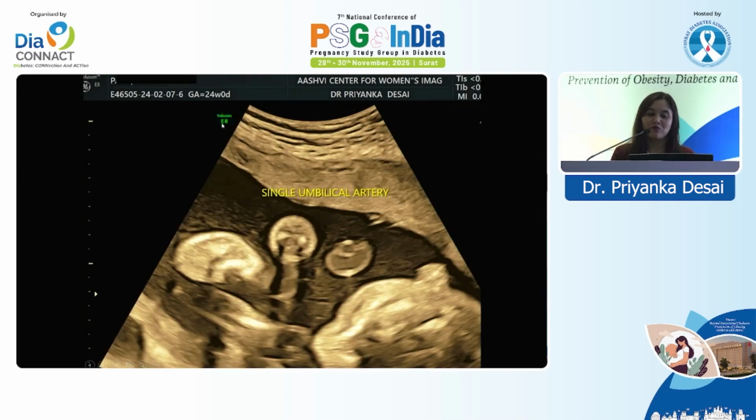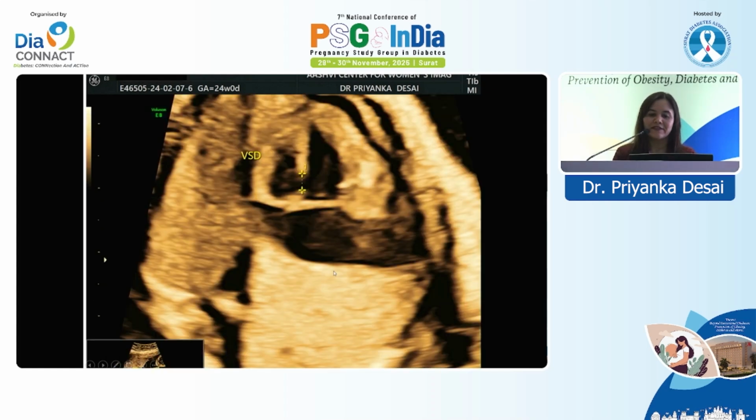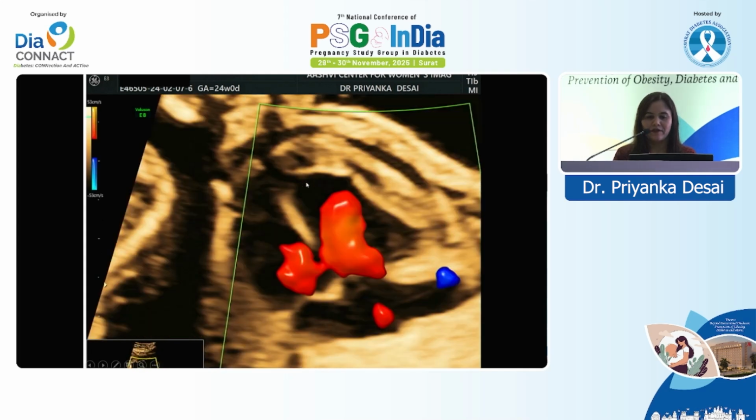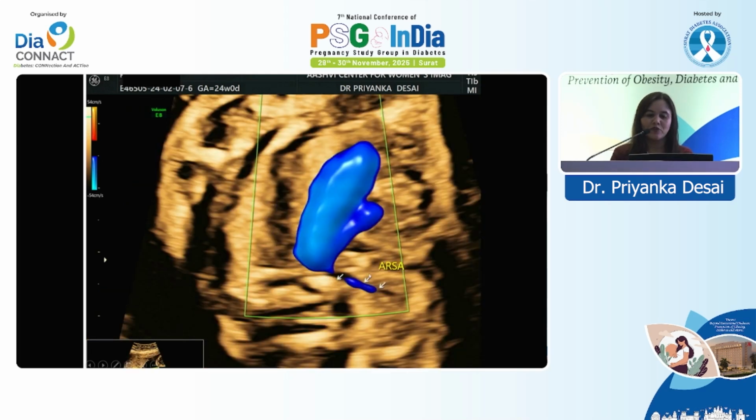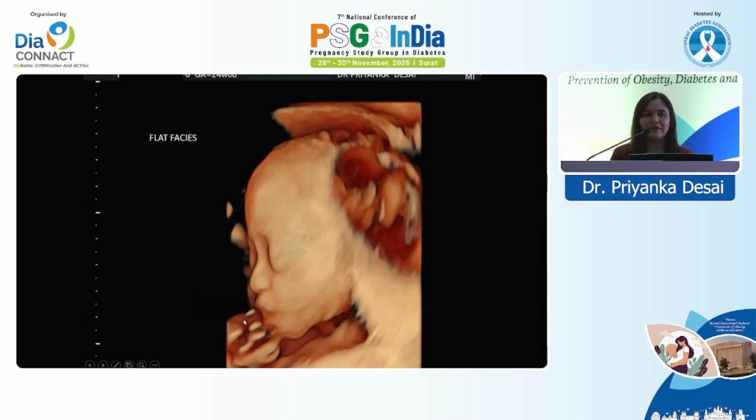Another patient, type 2 diabetic again. She came at 24 weeks for an anomaly scan, and this is a single umbilical artery over here. Duplex system on the left kidney. And here we can see the 4-chamber view of the heart where there's a big inlet VSD. This is a Doppler image which is showing us the VSD. She also had an aberrant right subclavian artery and an abnormal face. So again a flat face in this fetus.